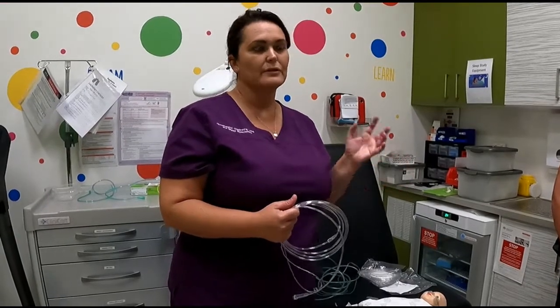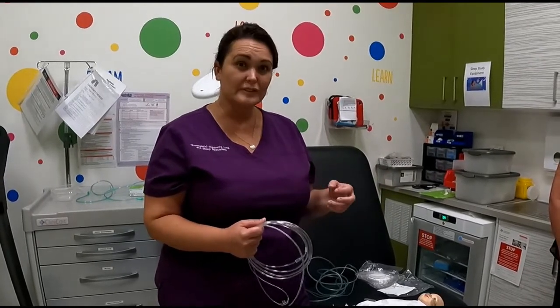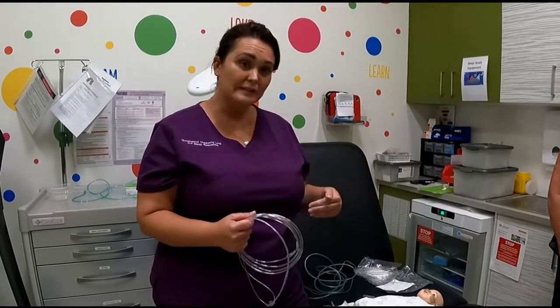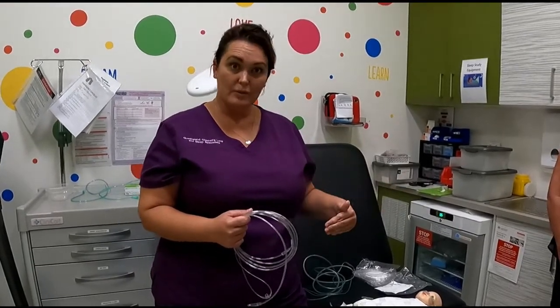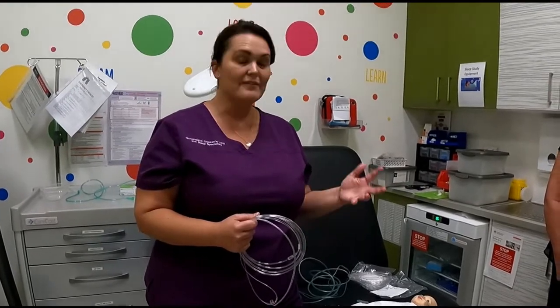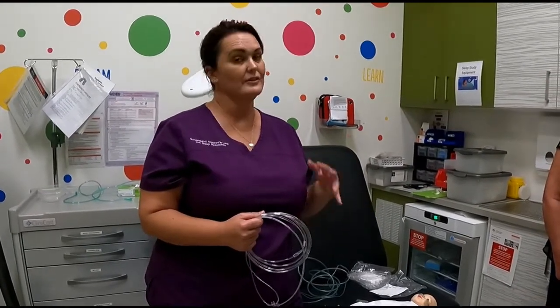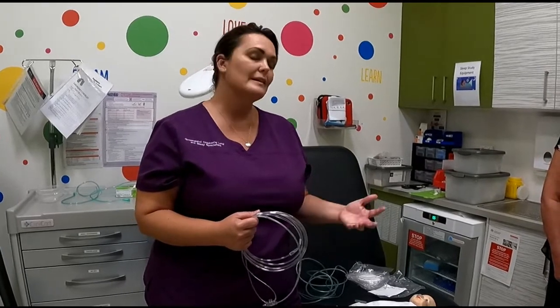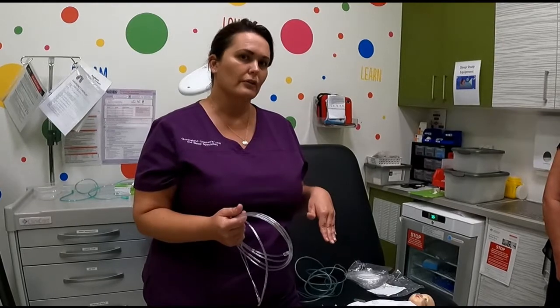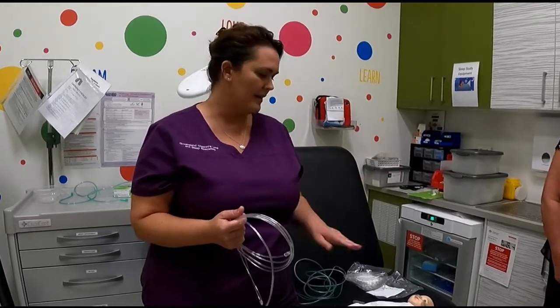If for some reason you were finding you were really going through your prongs because you were needing to change them every couple of days because of secretions, you may need to wash them out. It's step by step through the information in your white folder how to do this. But if you have any questions about that, you can certainly let me know. It's just something that you would very rarely have to do, but we will go through washing them out after this.